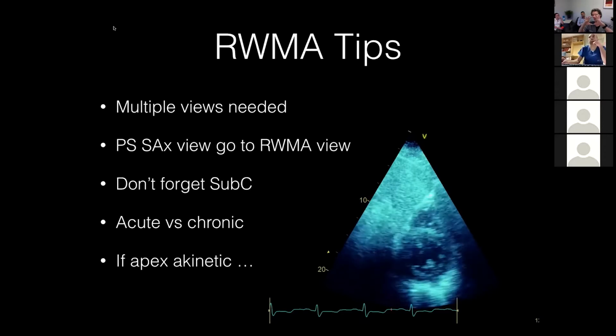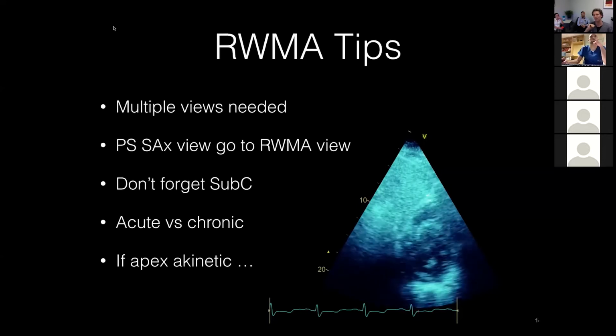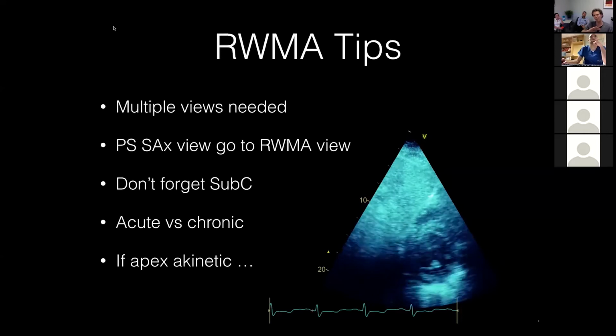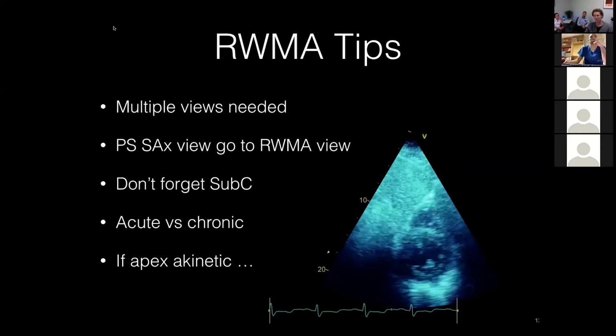And I always have it like a clock face, so that you're looking at either the segments that are above and the segments that are below. Again, we can talk about that in a little bit more detail, but trying to compare it like a clock face and being very systematic in your analysis is really important.